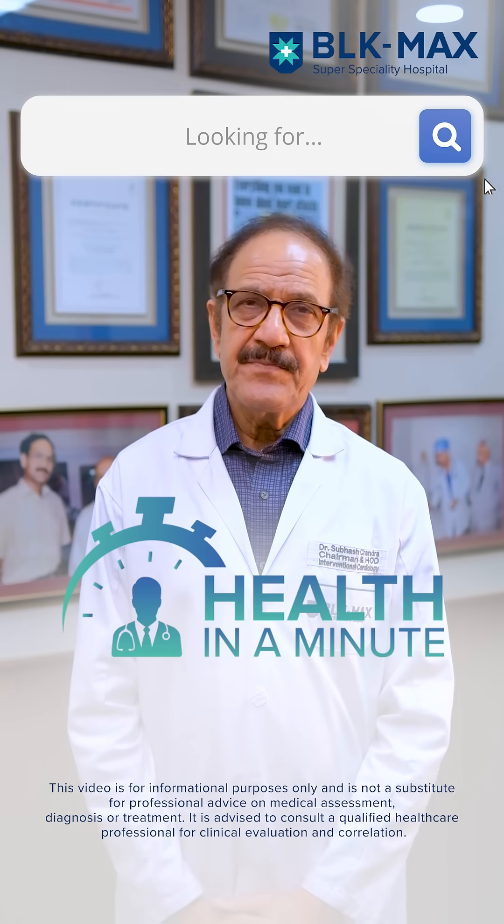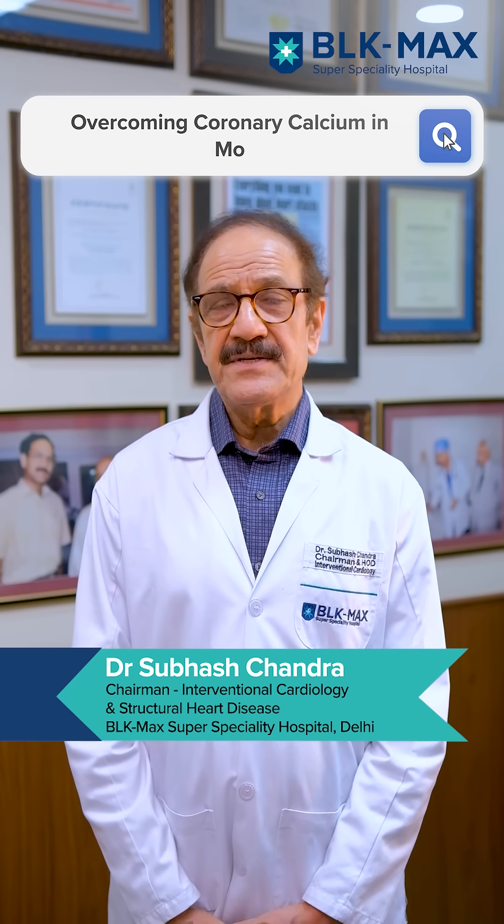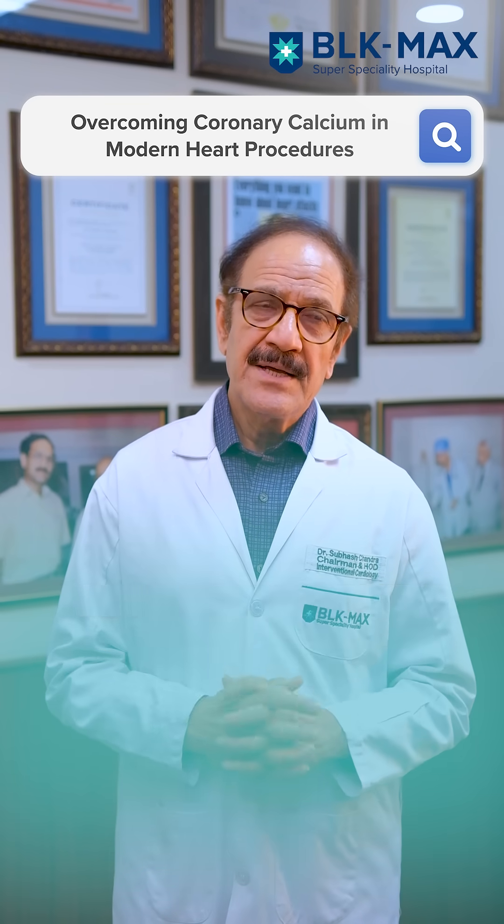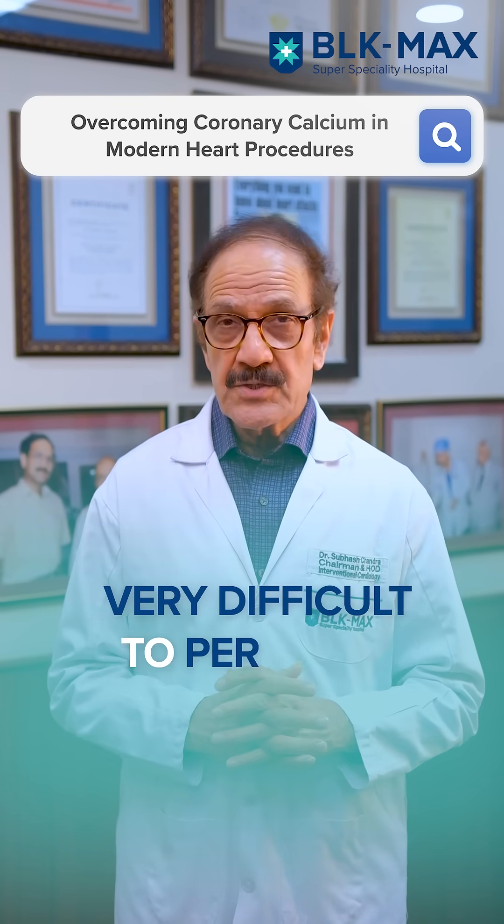Angioplasty is such an easy and safe procedure in good hands. However, there are times when there is a lot of calcium present in these coronary arteries, and that makes the process of stenting very difficult to do.